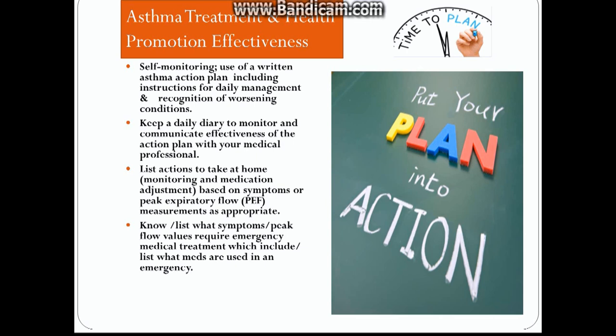Peak flow baseline numbers compared to peak flow numbers during an episode will give your doctor an idea about how many medications and what medications are needed to treat you. The comparison of the peak flow values helps medical professionals determine possible medical actions that are needed. They can also help you and the doctor determine if you need emergency care.